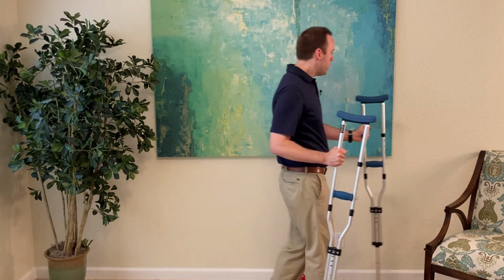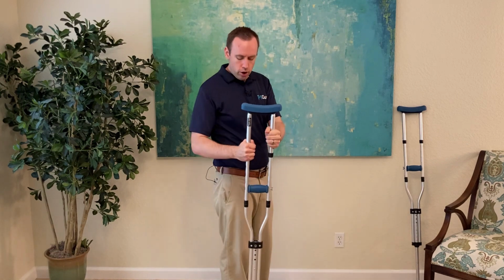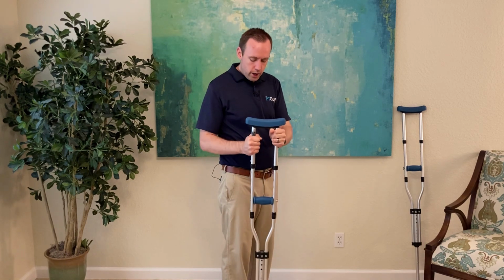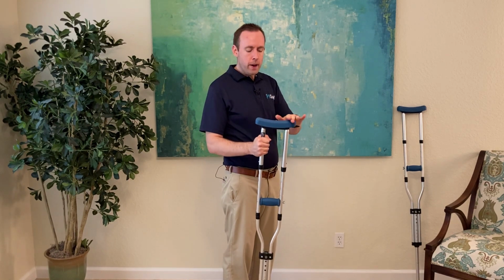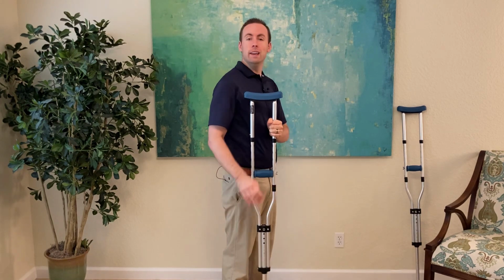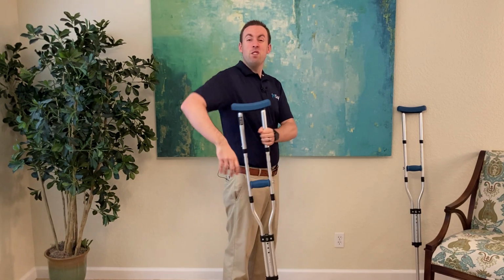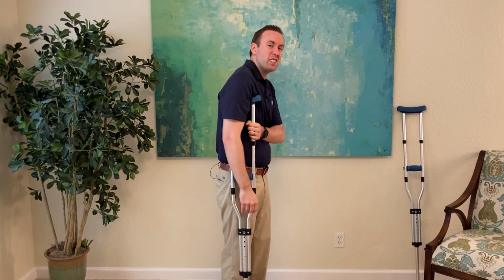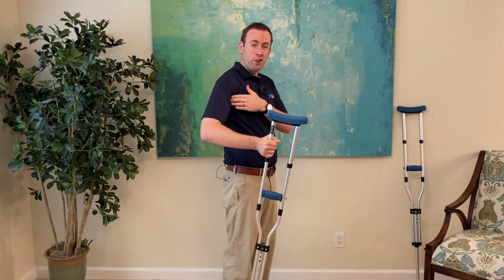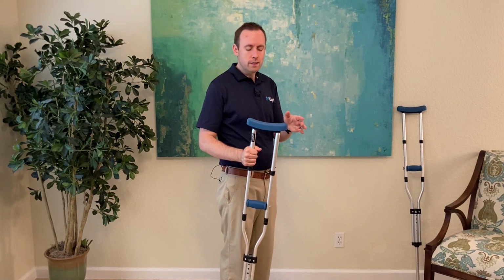As with always using crutches, make sure that your crutch is set to the right height. When you're setting your crutch to the right height, you want to make sure this pad is not cramming up into your armpit. Your armpit is not an armpit rest. If you put pressure down through here all the time and you lean on it, it's going to cram right up into your little nerves up here, and you could end up with nerve damage. You don't want to have any of that.